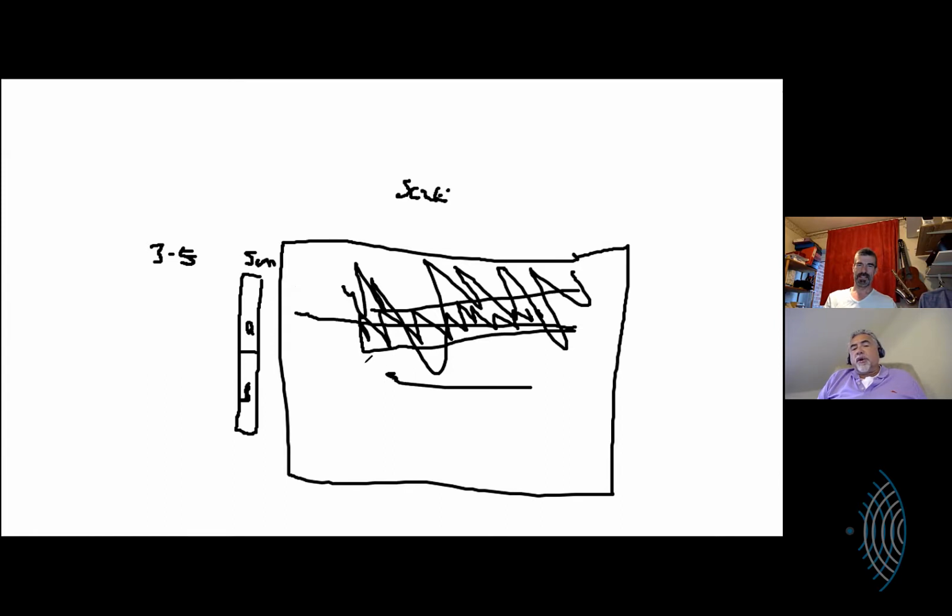John, I would not have a clue where you would change this number to 3 to 5. Is it just non-existent anymore? Because I know they have slow flow and fast flow. Is that doing the same thing? It may well be on your device. Every scanner I've driven has had an adjustment on the color. When you bring up color, there's always been a display there, and there's then a number at the top and the bottom, like 5 or 7.